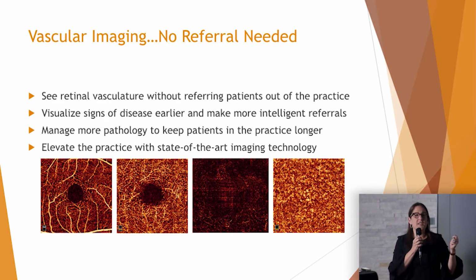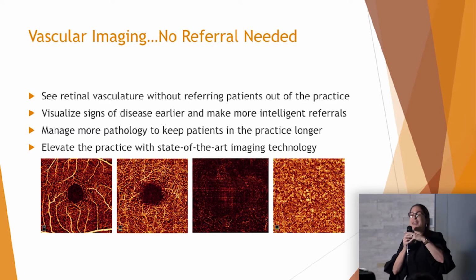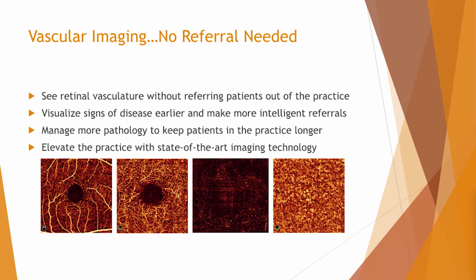My students will say to me, Dr. Rodman, I want the technology because I want to be the person on the block that has the coolest, greatest toys, right? And I don't really care why you want it, but I certainly feel like we're doing a disservice by not having it, okay? It's really been the best addition to my practice that I've had in a long time.